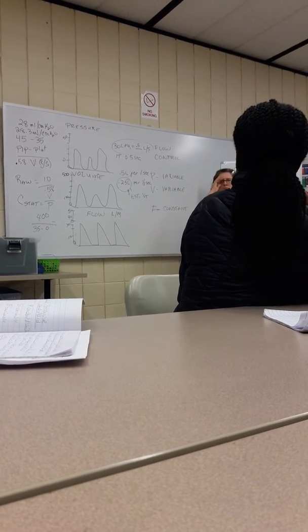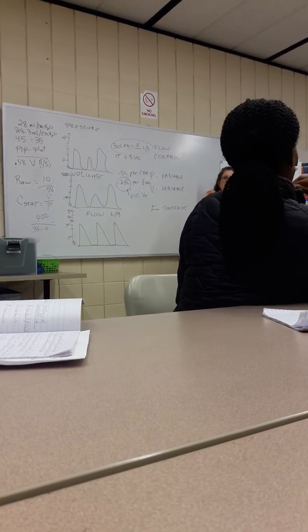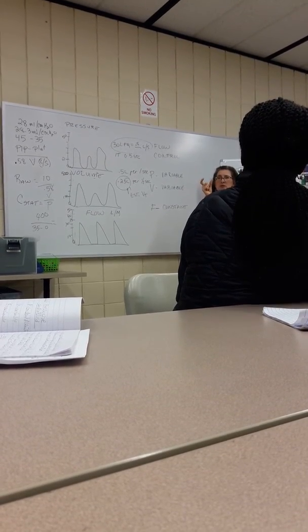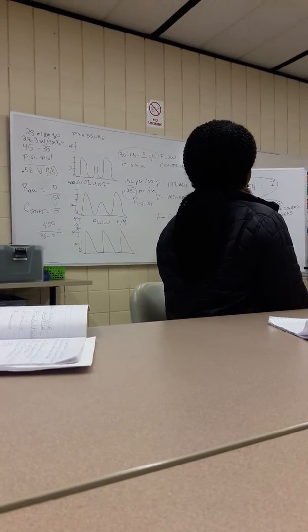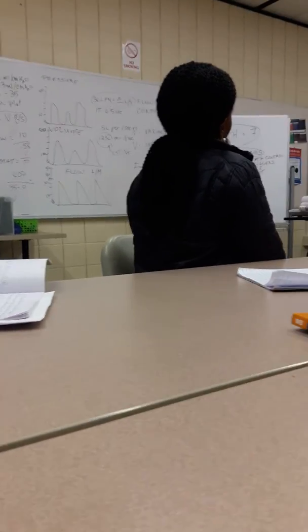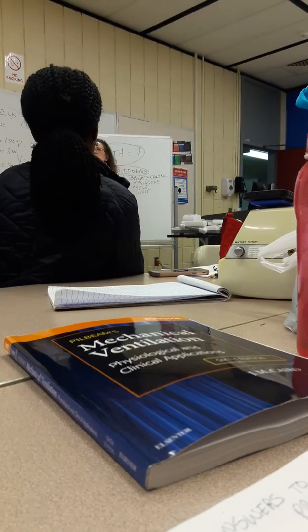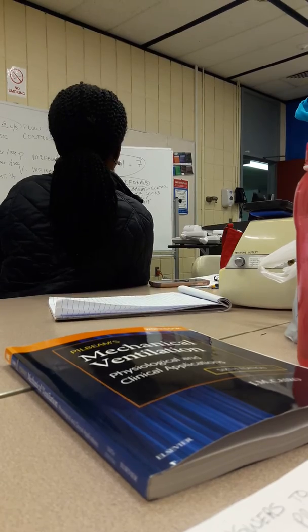What is the trigger for the ventilator in volume control? What will trigger the breath to start? Time. If that cycle time is coming to when the next breath is supposed to be and the patient hasn't triggered it, then it's time triggered. What is the cycle for the breath? When it stops inspiration. Therefore, what's the volume? It's gonna be volume cycled.